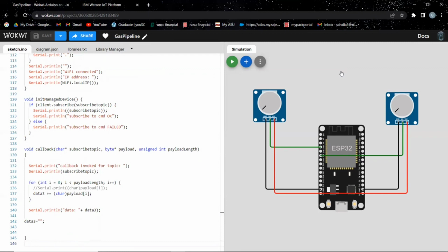Here we use two potentiometers, one representing the pressure values and the other representing the gas values. The connections are quite simple. You have to attach the ground of the potentiometer to the ground pin of the ESP32. Then the signal pin, which is for recording the potentiometer values, we have to attach to the analog pins of the ESP32. And then the VCC is known as the voltage input pin. We have to attach it to the voltage input pin of the ESP32, which is nothing but the VIN or 3V3 pin.